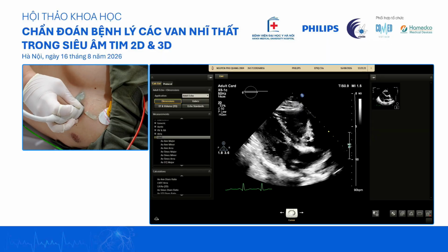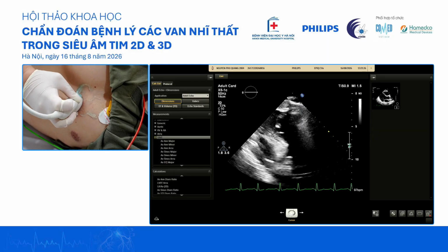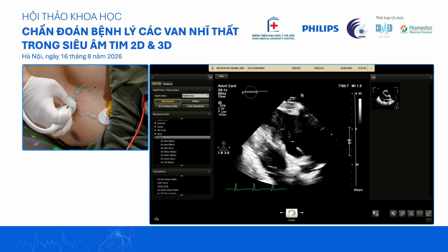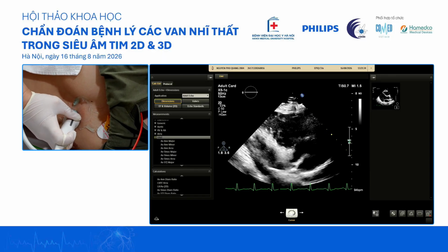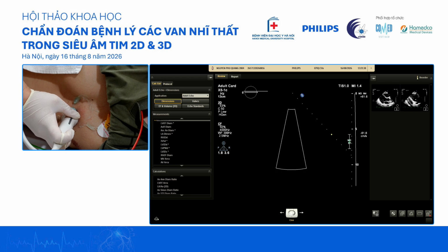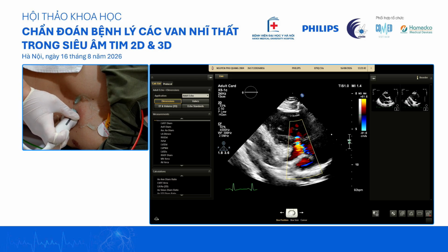So we will look at the RV inflow. Let's just take a look at the tricuspid regurgitation first.